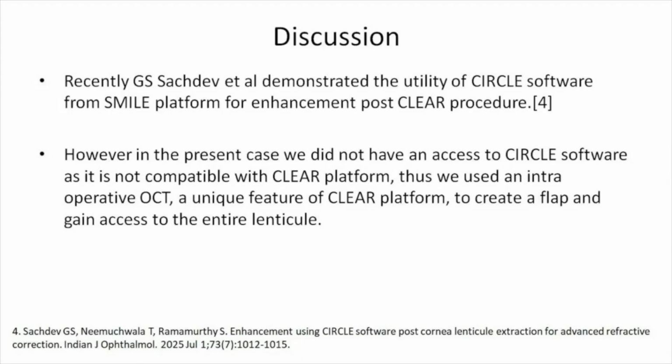demonstrated the utility of CIRCLE software from the SMILE platform for enhancement post-CLEAR surgery. However, in the present case, we did not have access to CIRCLE software as it is not compatible with the CLEAR platform. Thus, we used intraoperative OCT, a unique feature of the CLEAR platform, to create a flap and gain access to the retained lenticule.